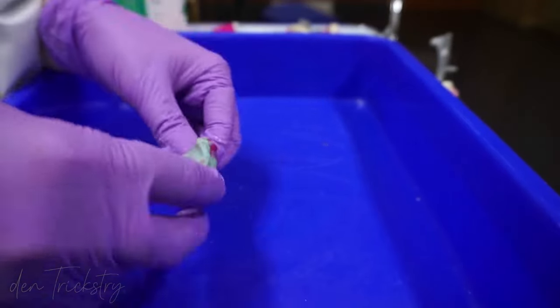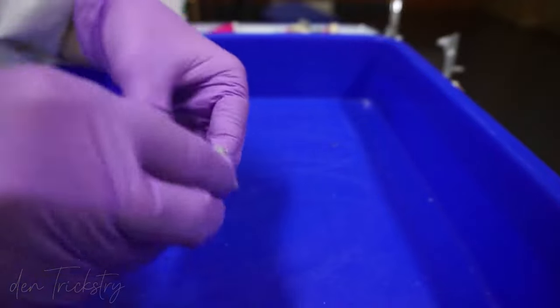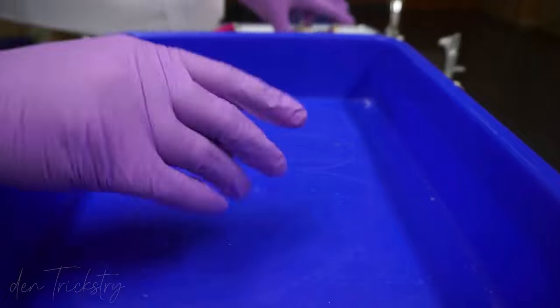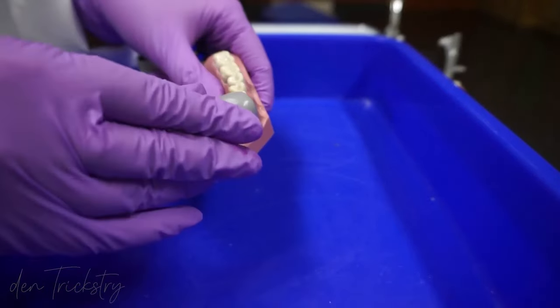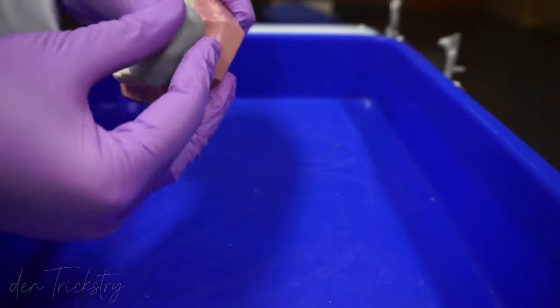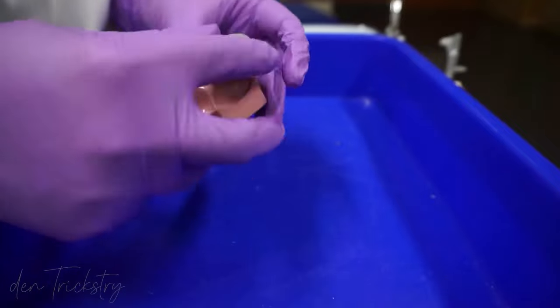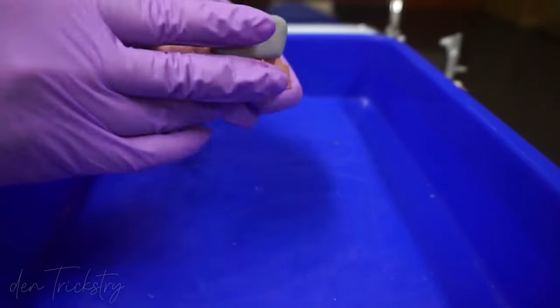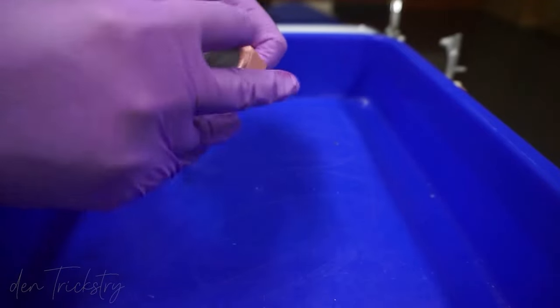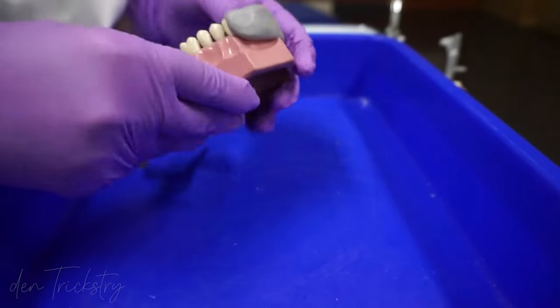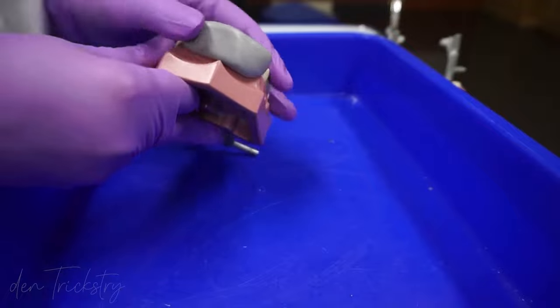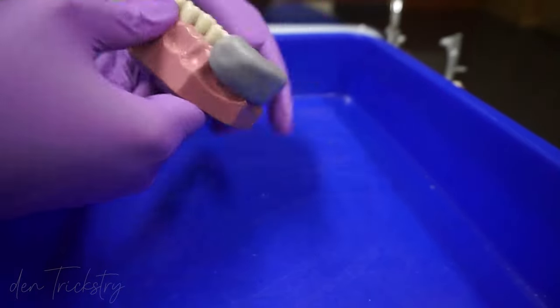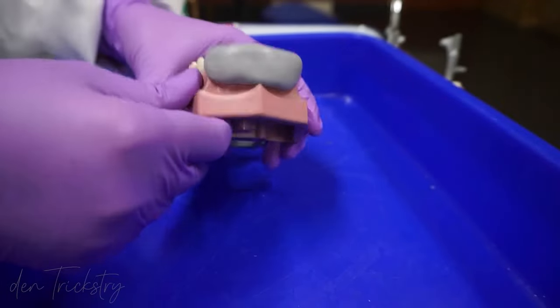After mixing the catalyst with the putty material, I knead it till I get a nice homogenous mix. Once mixed, we have to place the material on the area we want to temporize. In this case, it is the upper anterior tooth which has to be prepared for a crown. Place the material covering the tooth surface entirely and make sure you extend to the adjacent teeth as they are going to serve as the vertical stop and prevent sinking of the index once the tooth is prepared.